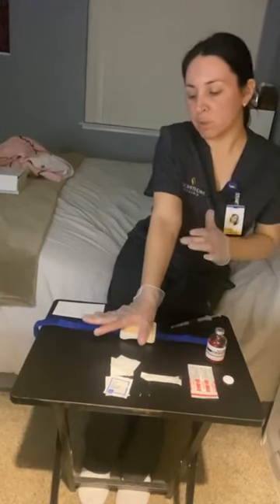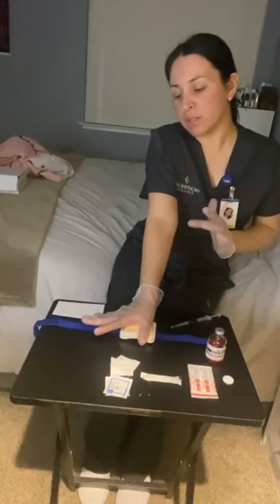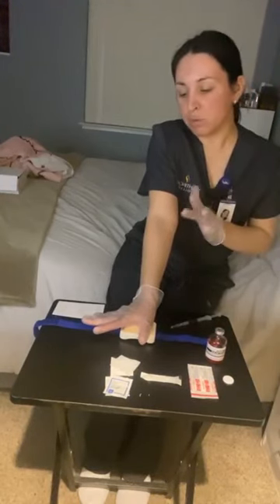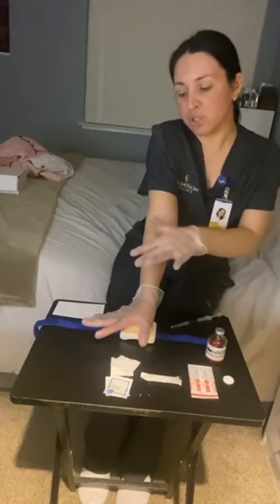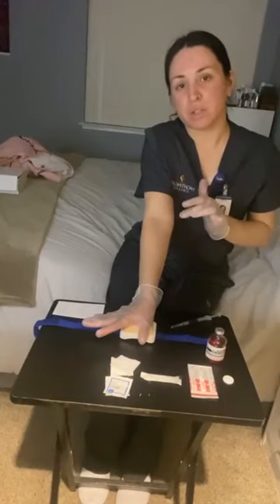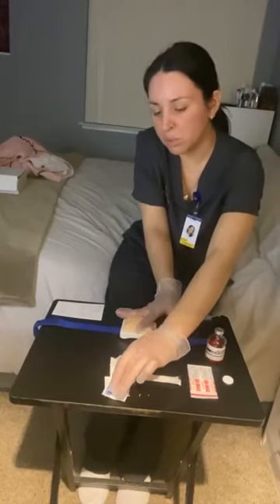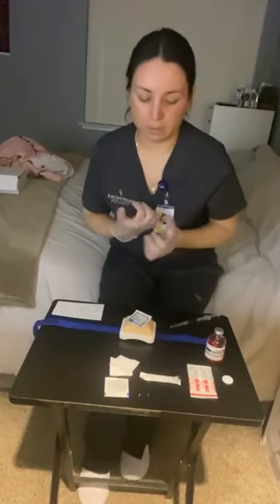My middle finger is going to extend toward the iliac crest toward the buttock. And so the index finger and the middle finger and iliac crest form a V shape, and the center of that is going to be the injection site. So we'll pretend this is it. So the center, and I can use an unopened alcohol swab as my marker. So I'm going to place that there.